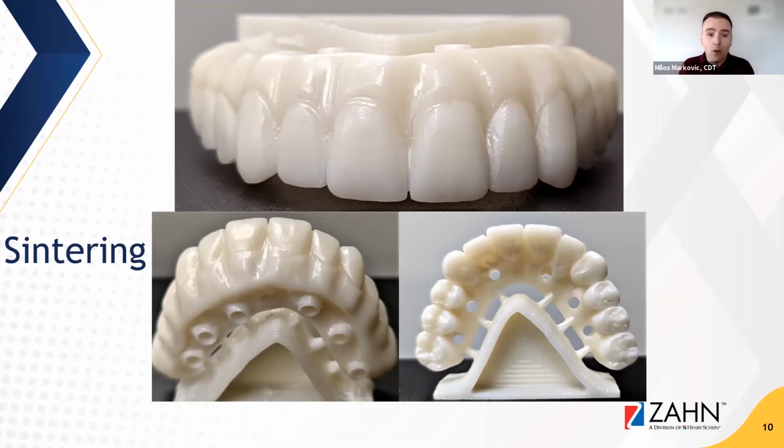And that's another thing. All these new discs that are coming out onto the market, they're all pre-shaded. The benefit of that is tremendous. It streamlines the workflow. We don't have to spend a lot of time pre-staining them. And the shades are just getting better and better. And if you can see here, even at this stage, when it's just been sintered, we're already starting to see some of that translucency that exists in the material. So it's already starting to look promising.